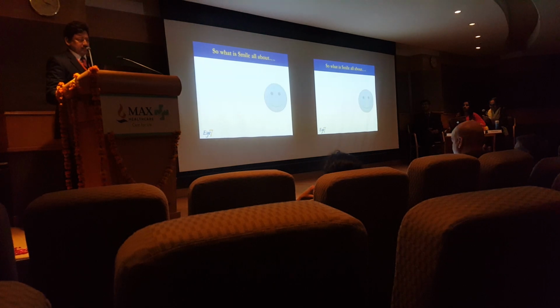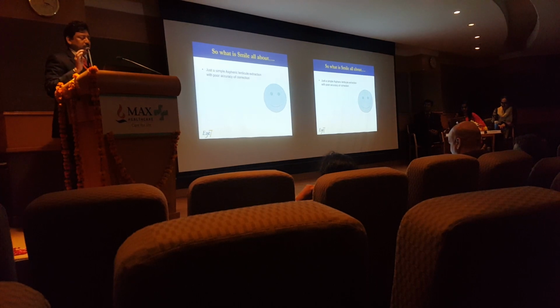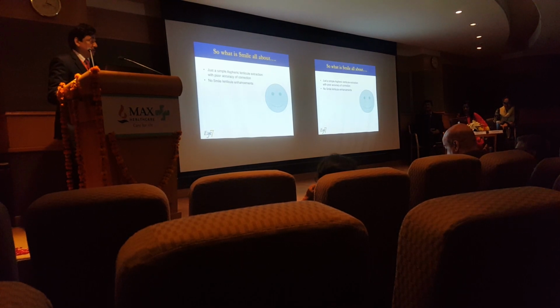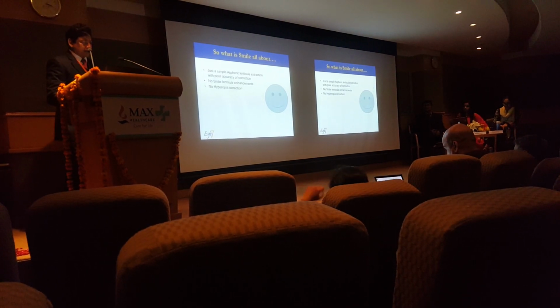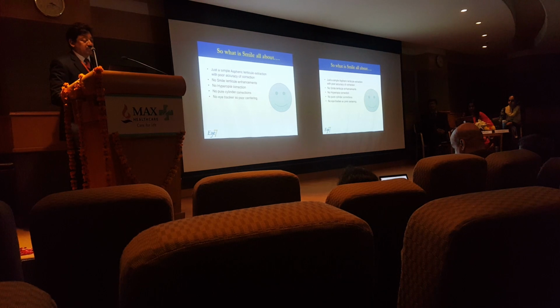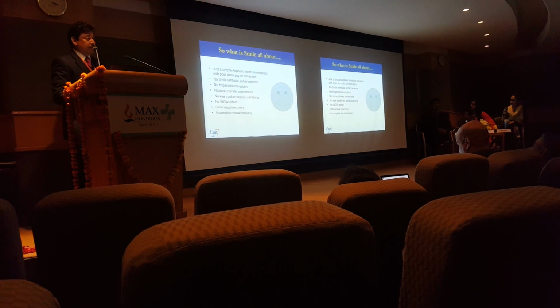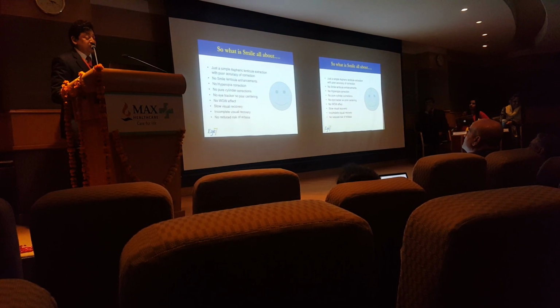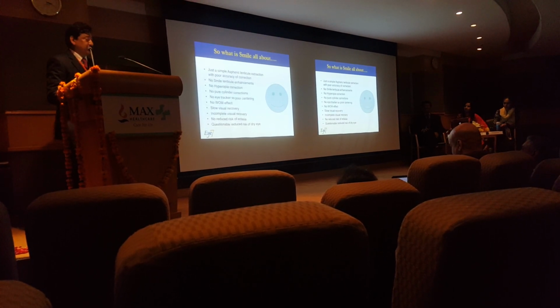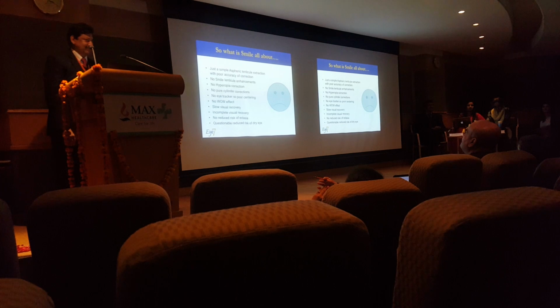Last line. And this is the last line. So what is SMILE all about? It is just a simple aspheric lenticule extraction with poor accuracy of correction, no SMILE lenticule enhancements, no hyperopia correction, no pure cylinder correction, no eye tracker, so poor centering, no wow effect, slow visual recovery, incomplete visual recovery, no reduced risk of ectasia, and questionable reduced risk of dry eyes. Thank you. Cannot do mixed astigmatism also.